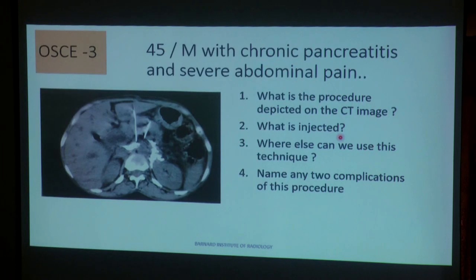In this patient, we initially inject contrast so that we are sure that whatever we inject is not going into the vessels or the celiac, and we can find the plane of injection. If it is difficult to put 2 needles, we can put 1 needle, inject the contrast, see if it spreads bilaterally, then you don't need to put 2 needles on either side of the celiac axis. So this contrast is just to see where the injection of your chemicals will go.